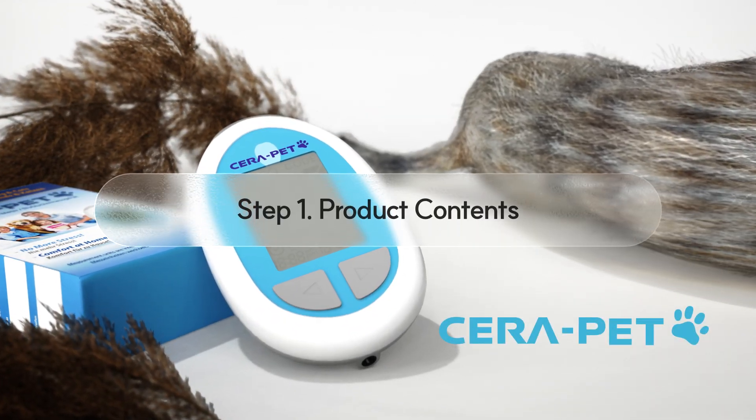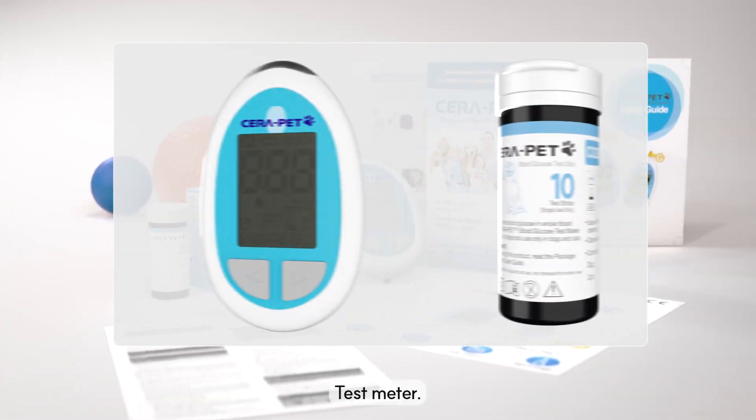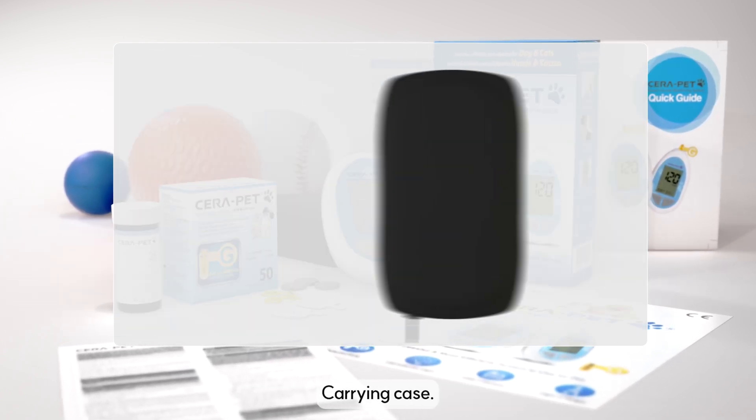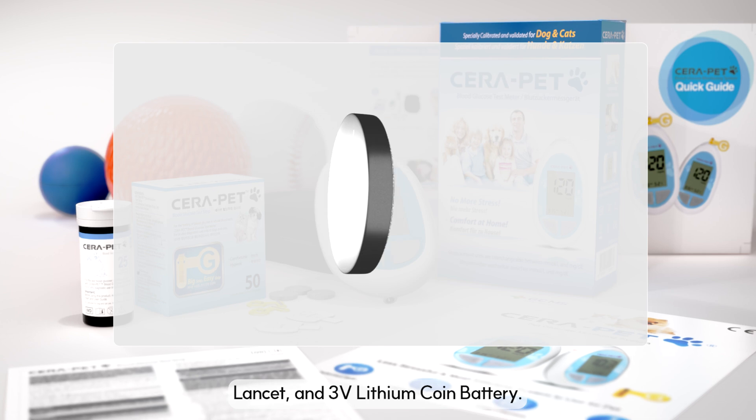Step 1: Product contents. The Serapet meter package includes test meter, test strips, code key, quick guide, user guide, carrying case, lancing device, lancet, and 3V lithium coin battery.